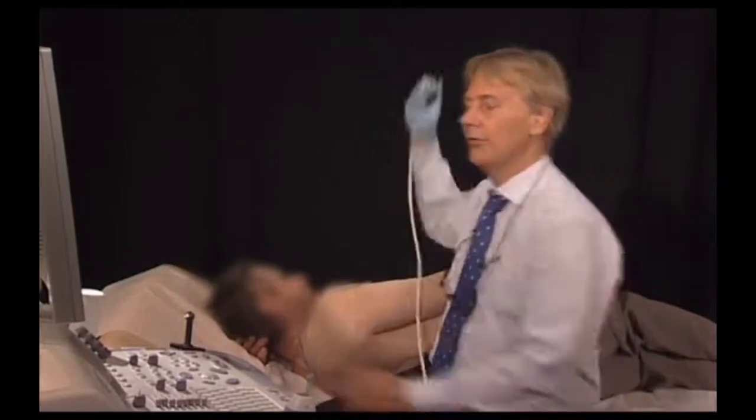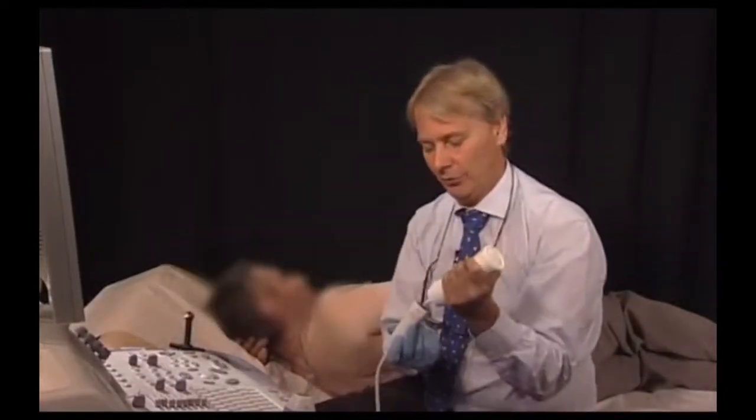Now I would like to take you back to a how-to session, and I want to show you how we can actually differentiate the different segments of the mitral valve with the help of echocardiography, first with the parasternal approach. So let's see how we can actually differentiate between the individual segments.